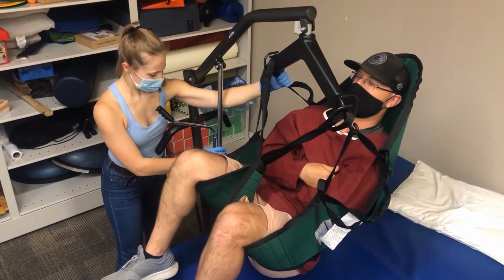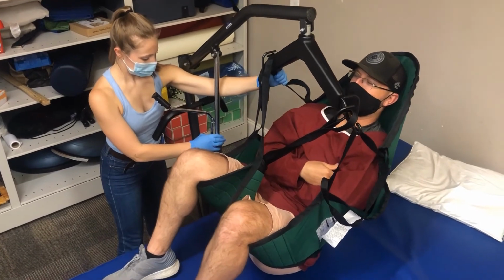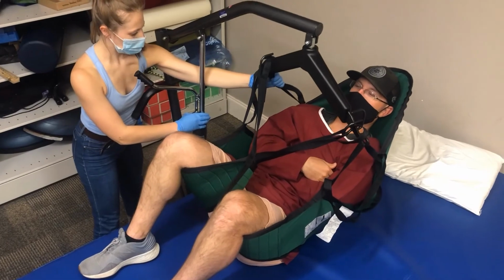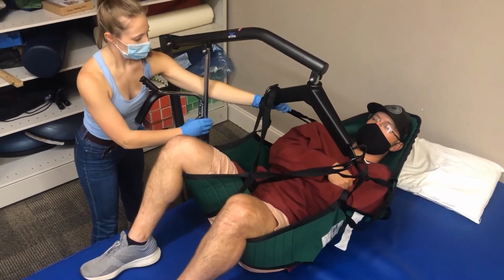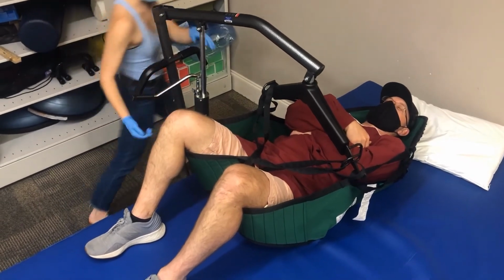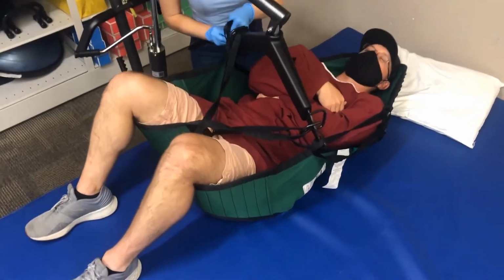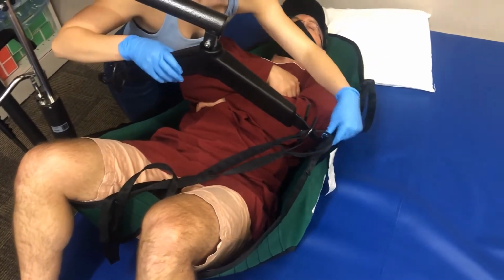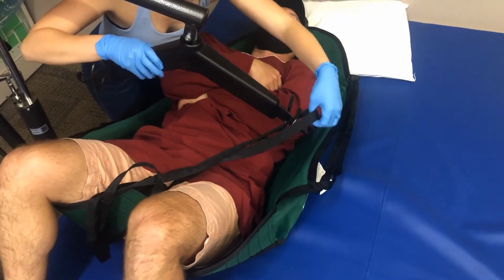Once your loved one is directly over the bed, lock the brakes on the Hoyer. Slowly turn the metal handle to lower your loved one into the bed. Undo all of the straps on the sling, and the transfer is now complete.